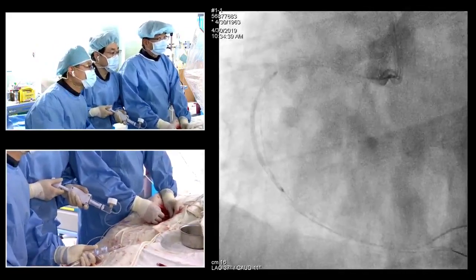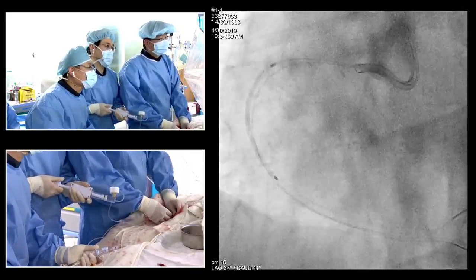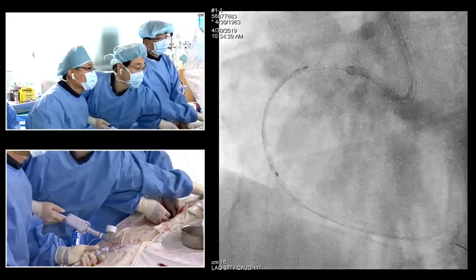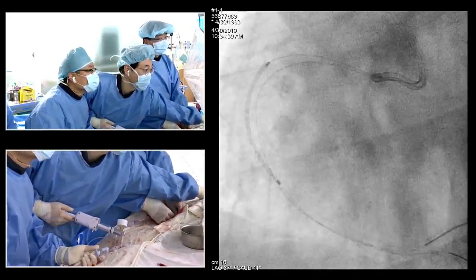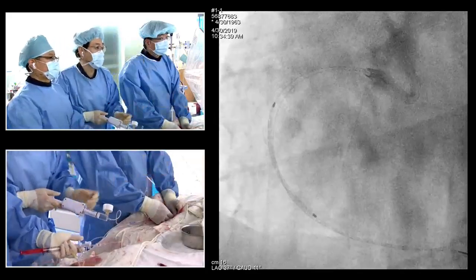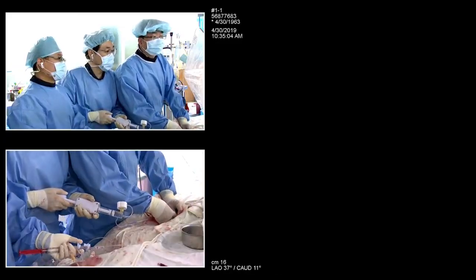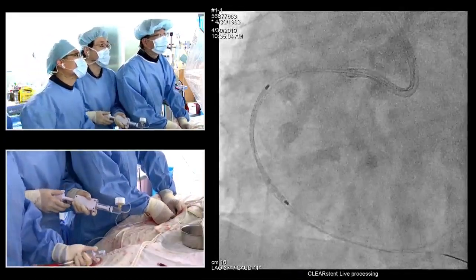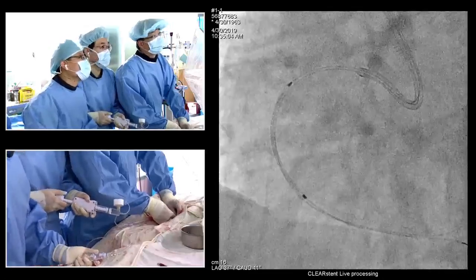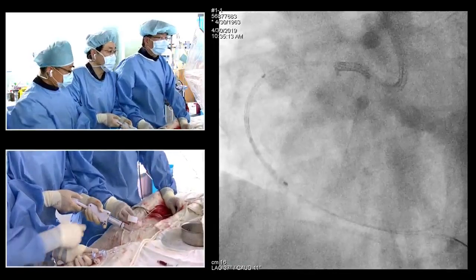So what size is this? 3.5. So probably you have to postdilate a little bit the 2.5 stent, so as not to make a concertina or something, you know. Okay. Yeah. With a bigger balloon. Okay. It's working. Just a moment. Which size is it? 3.5. But which one? Is it Synergy, Alpine or Pro? Sierra. Okay. So maybe at this moment I want to remove the side branch wire.